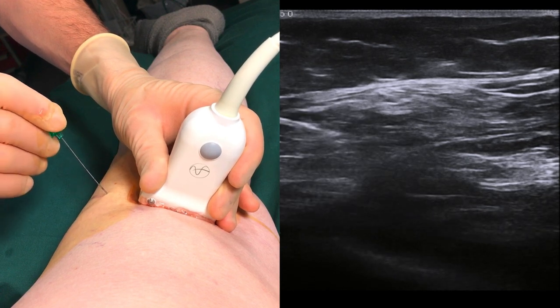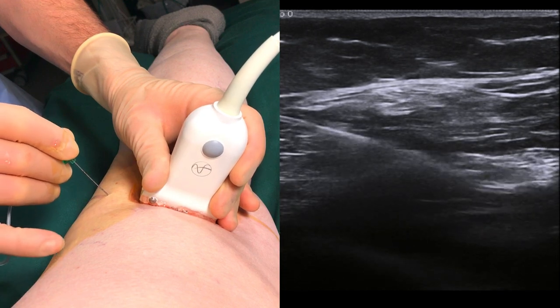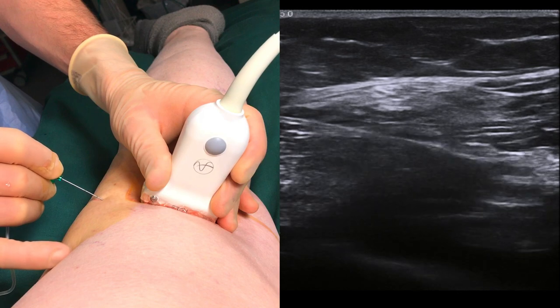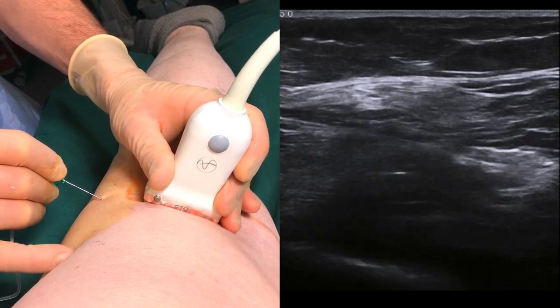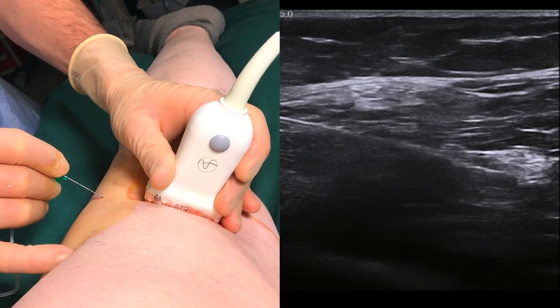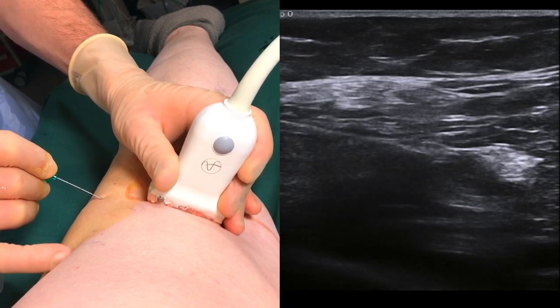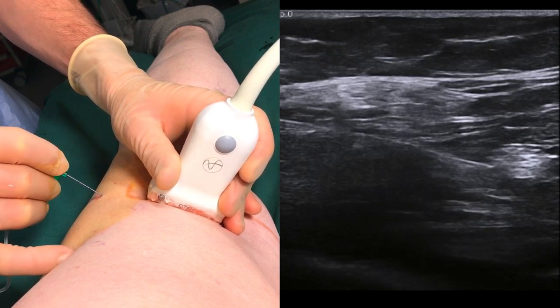Try to keep the needle visualized in plane as you approach the nerve. When the needle is in position, start injecting the local anaesthetic. This can be done either continuously or in staggered doses — this is a matter of personal preference. Work the needle around systematically in order to assure a good spread.